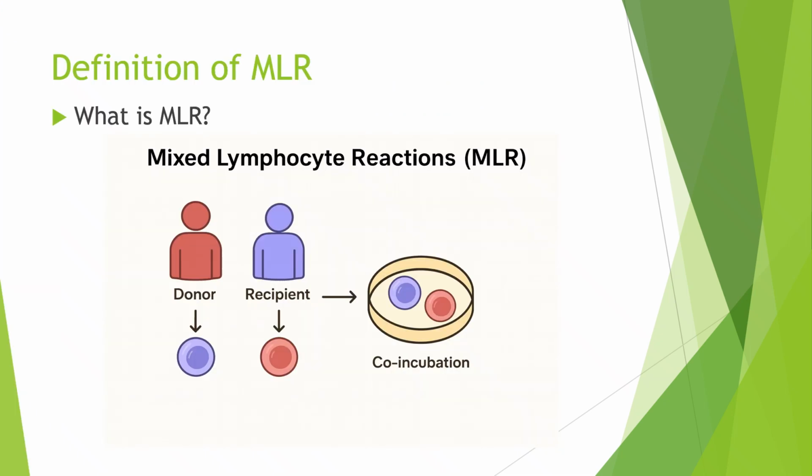First, let me explain the definition of MLR. Basically, we mix white blood cells from a donor and a recipient in a dish. This is called co-incubation.